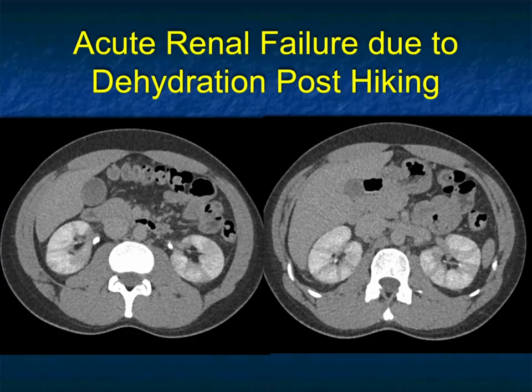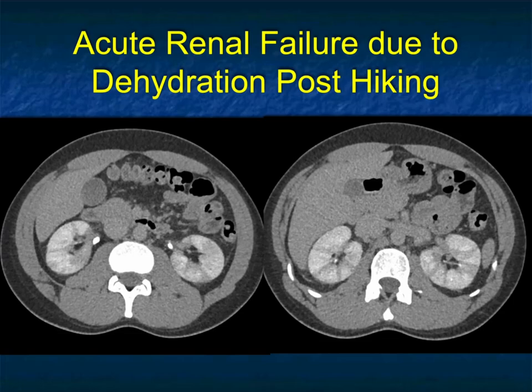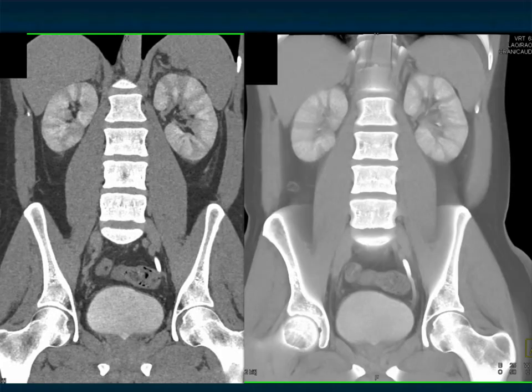Here's an interesting case — this patient was found down after hiking without enough water, became lost and disoriented. You can see areas of decreased attenuation in the kidneys with lack of good cortical medullary differentiation. This is acute renal failure due to dehydration. It's uncommon, but as we think about climate change and hiking incidents, this is how patients may present — with decreased attenuation and striated nephrogram due to acute renal failure, shown nicely on coronal views.